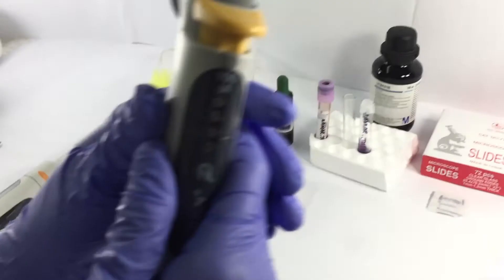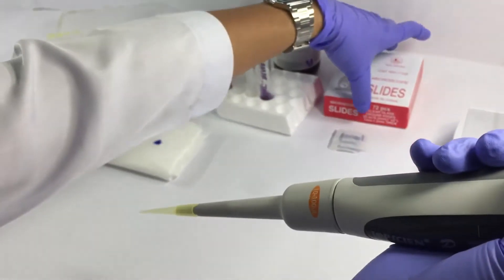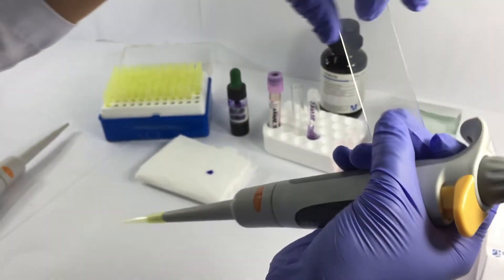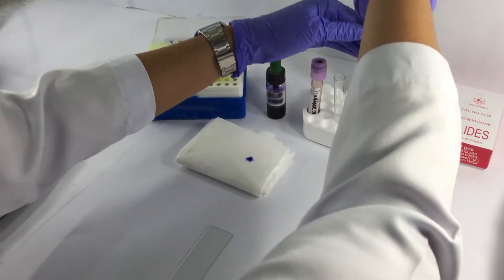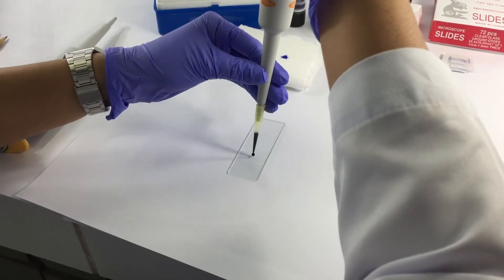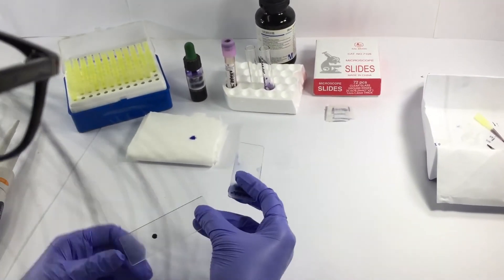Right after incubating the sample at room temperature, get your micropipet and set the calibration to 50 microliters. Attach the pipet tip into the micropipet and prepare a clean slide. Next, aspirate the mixture of the stain and the blood sample, place a drop of the mixture on the slide, and perform a wedge smear.